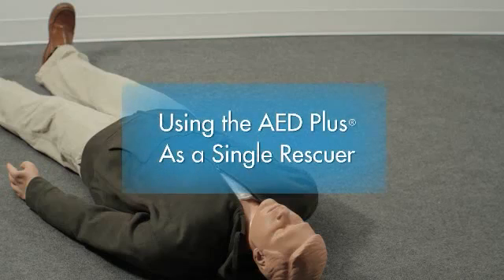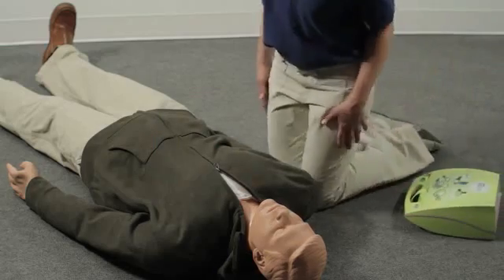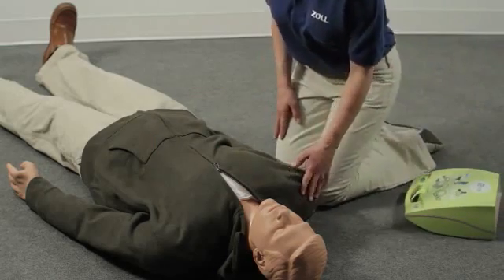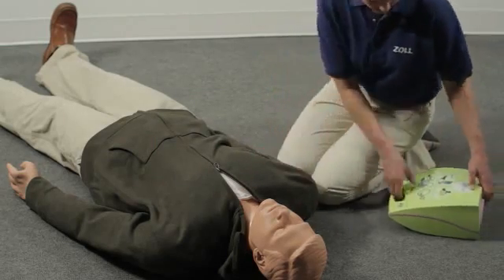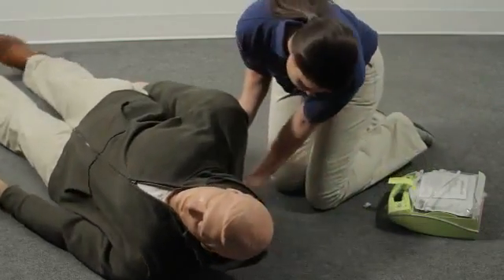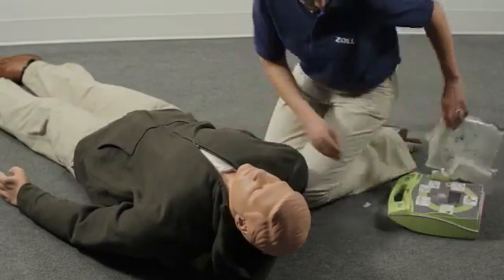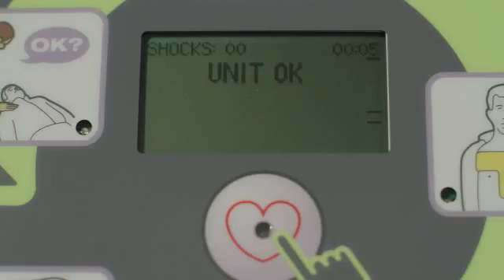Using the AED Plus as a single rescuer. Watch, don't practice the following demonstration. Position the person away from contact with water and metal. If the victim's upper body is not injured, use the lid as a support to help keep the airway open. Position it between the shoulder blades. Place the AED Plus by the person's shoulder. Turn it on and follow the prompts.